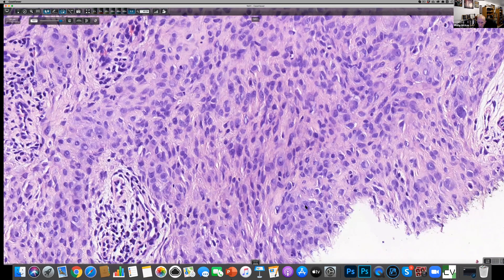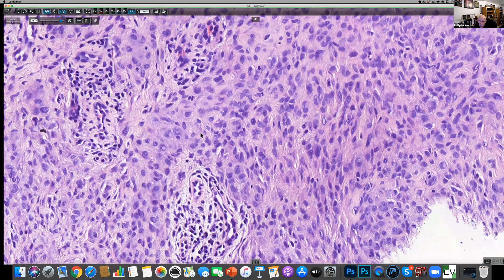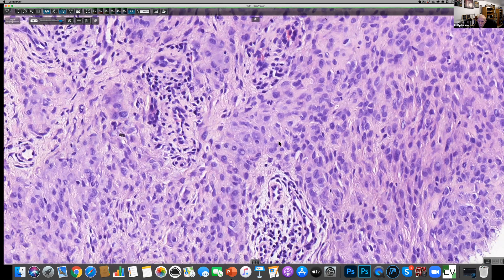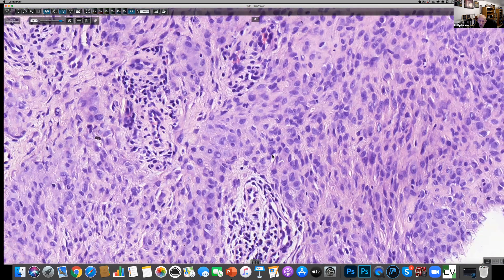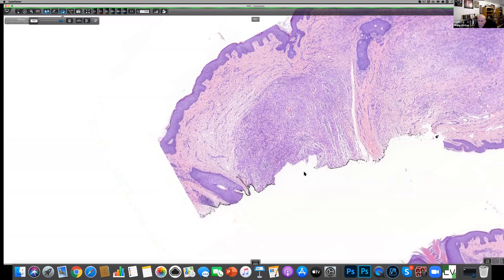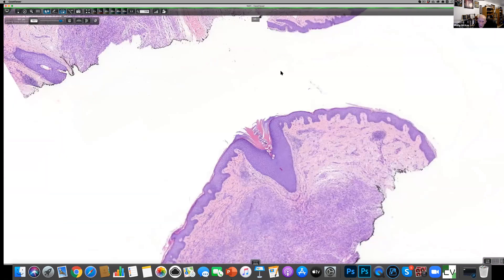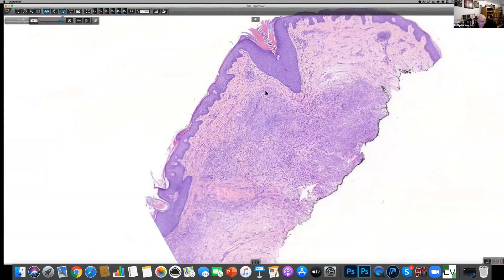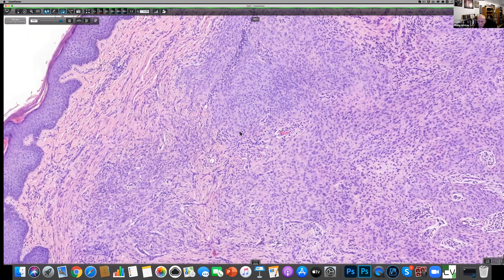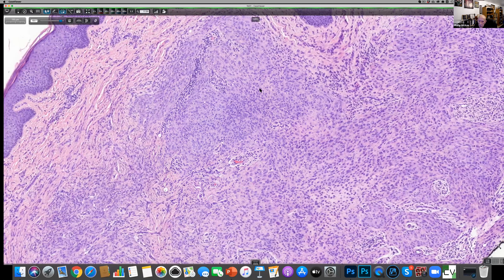Some of the cells are plasmacytoid. You might wonder about some sort of a histiocytic lesion, but I'd be hard pushed to think of one that would have this growth pattern. This is another piece of the tumor and it shows pretty much the same features.